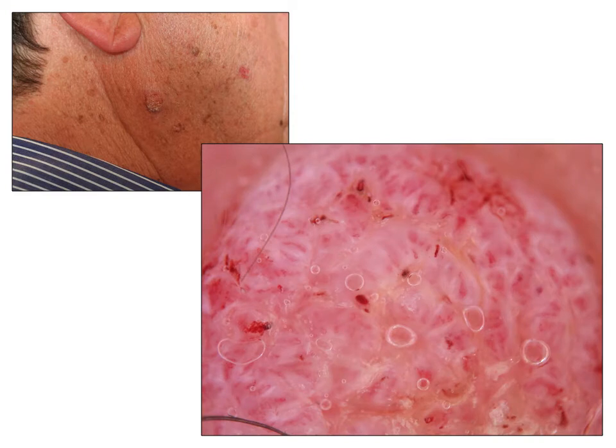So these hairpin-like vessels, papillary vessels, seen from the side, are always with this whitish halo, and their aspect changes if you change the position of the dermoscope. It means that for some of them, you can observe them as hairpin-like vessels seen from the side, but a glomerular aspect is also possible if the angle of vision is different and you can see them from the top.